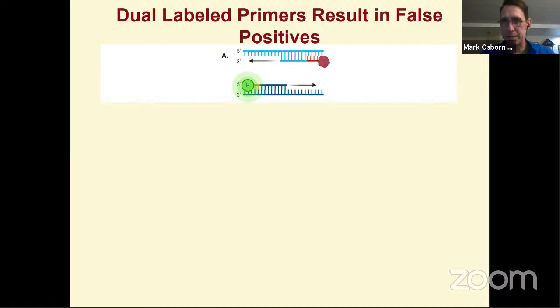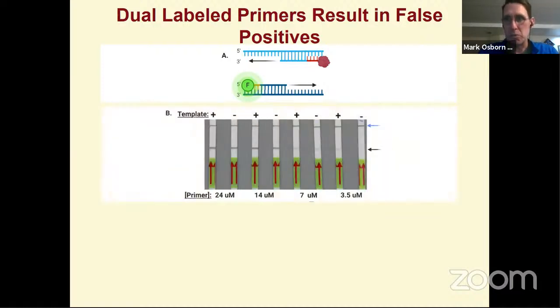And so operating on the principle that lateral flow assay technologies can be performed closer to the patient at the point of collection, we started to build a program around how we could detect these nucleic acids using lateral flow assay technology, which again requires a FITC and biotin labeled analyte. And what we first did was use dual labeled primers, one forward PCR primer labeled with FITC, which is a simple chemical modification that most oligonucleotide vendors offer. Likewise with biotin, these can be physically conjugated to the oligonucleotide and easily ordered from most companies that produce oligonucleotides.